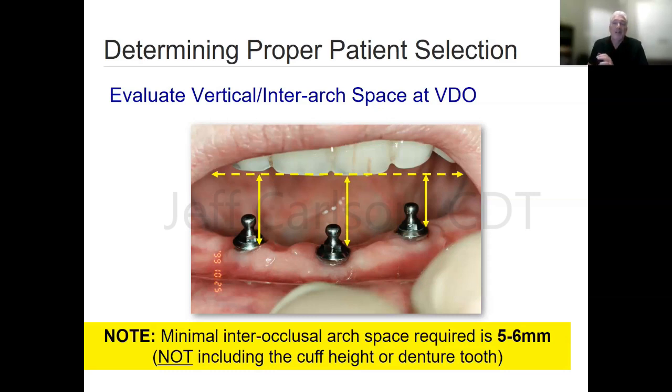That's freeway space. Typically, you want to have around 3 millimeters of freeway space when you're doing these removable prostheses. If not, the patient's teeth are going to be bumping during speech, and it's going to drive them crazy. So we're not going to get into establishing vertical that much tonight. Tonight was more of a broad overview. That's something we could get more in depth with in some other courses, being really specific on different topics, maybe just doing one-hour-long meetings on those.